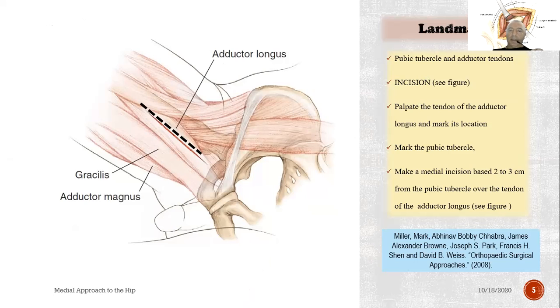Incision: palpate the tendon of the adductor longus and mark its location. Mark the pubic tubercle. Make a medial incision based 2 to 3 cm from the pubic tubercle over the tendon of the adductor longus.